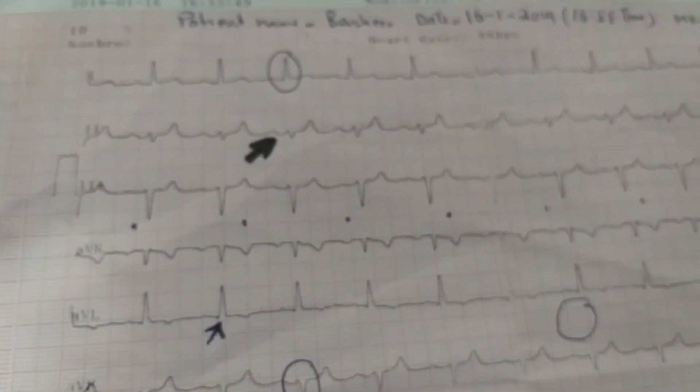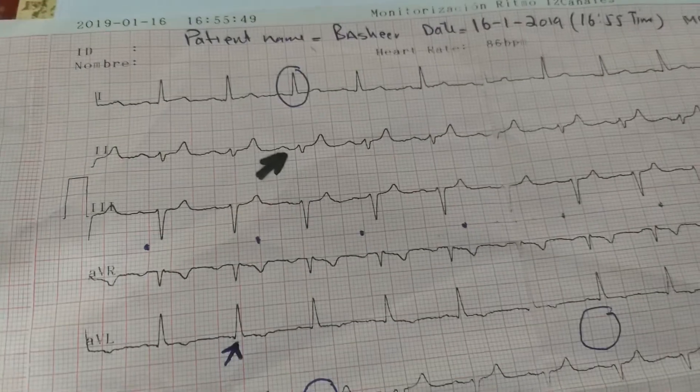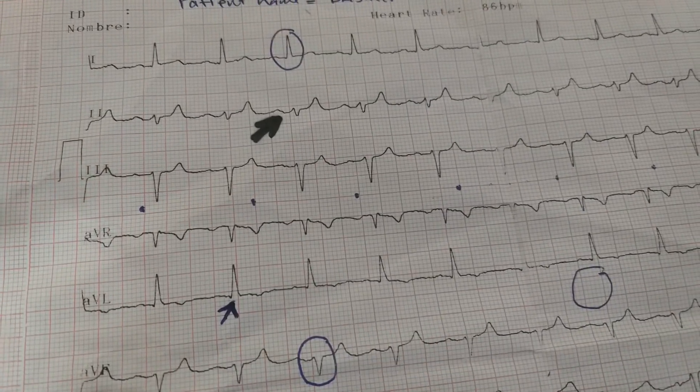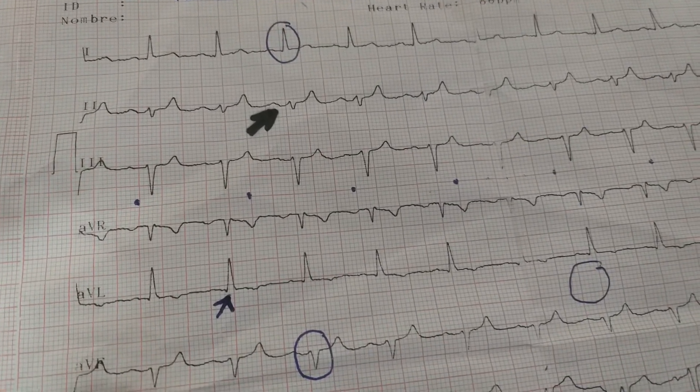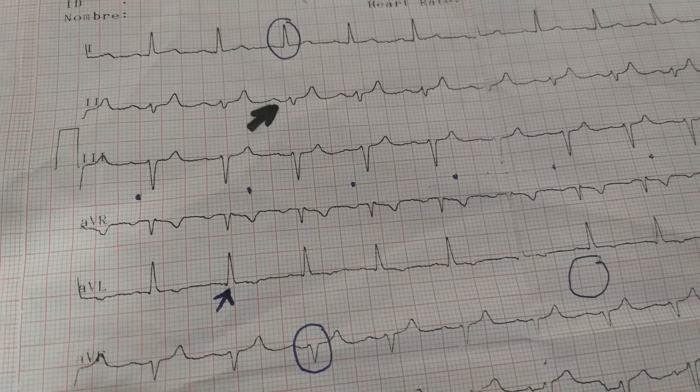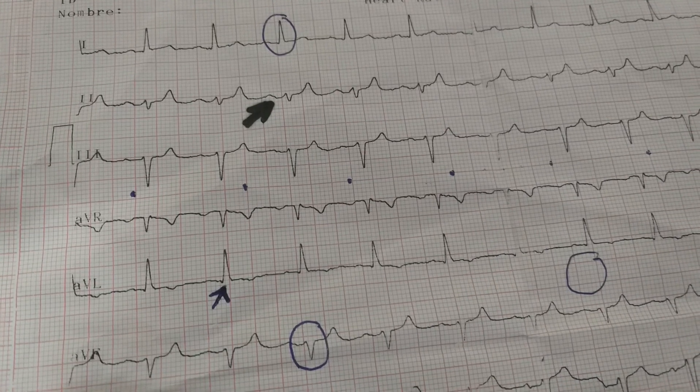Our patient has not got P mitrale, so there is no left atrial hypertrophy. These are the four types of hypertrophy — when we look at an ECG systematically, we can read it and determine whether the patient has any chamber hypertrophy.